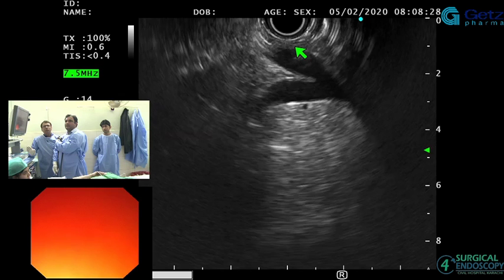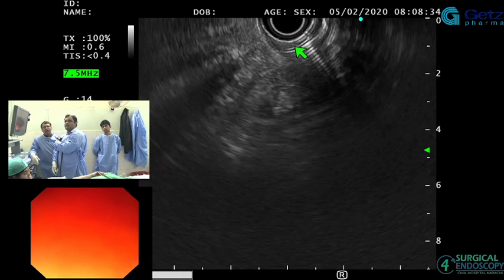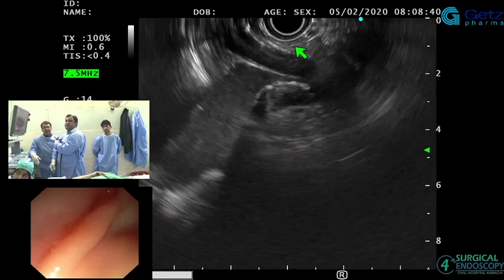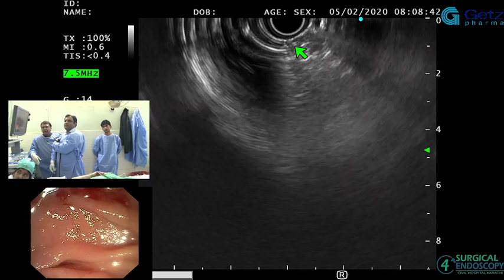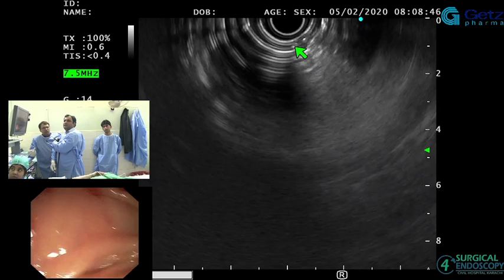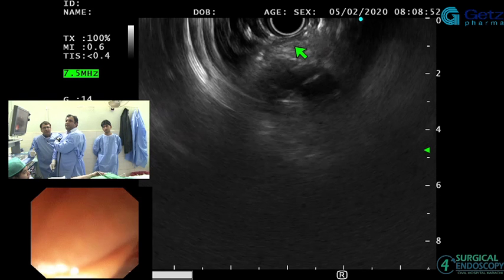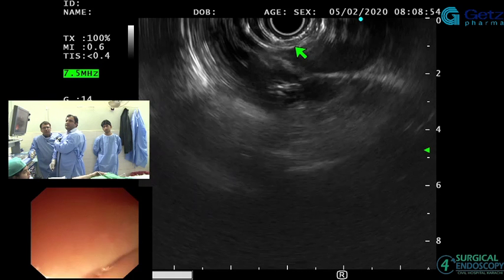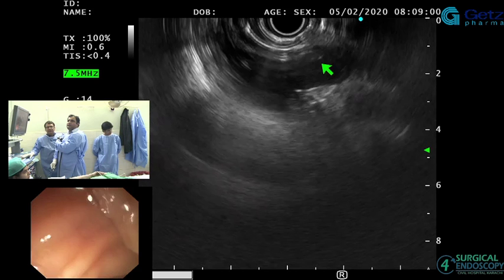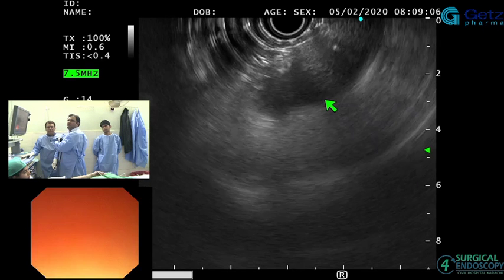So now let's find our landmarks, which are? Aorta, or IVC, or pancreas, one of those, so we can follow the rest, okay? You went quite deep in there, and she also had a surgery, so it's not going to be that deep. You see the aorta, perfect. Withdraw further, good. You see the IVC right on top of that. So IVC is right here, rotate further to the right, and pull the scope back, big wheel towards you. You can step back, always. Take a step back. Okay, good.